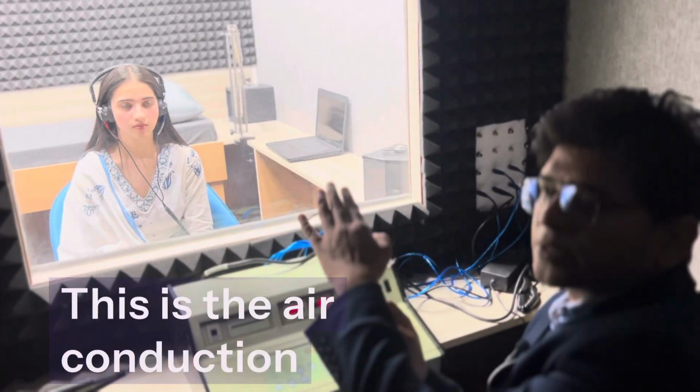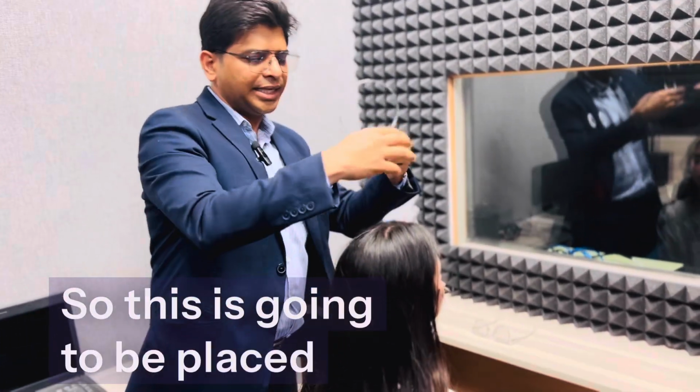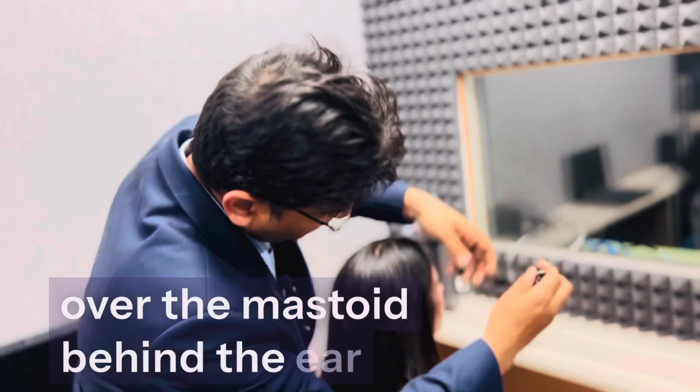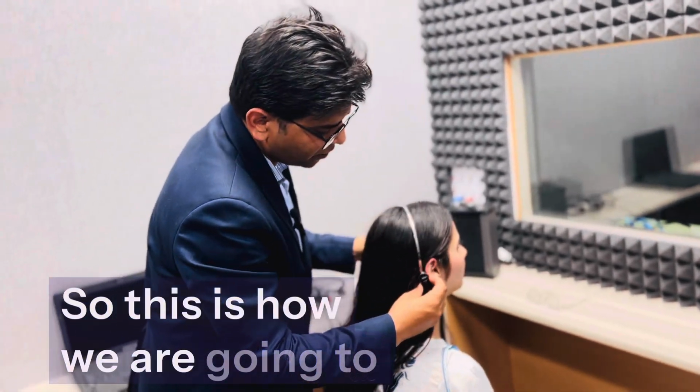This is the air conduction. Now I will be showing how a bone conduction is. This is the bone conduction band. So this is going to be placed over the mastoid behind the ear. Shagun, please help me with this. So this is how we are going to place it.